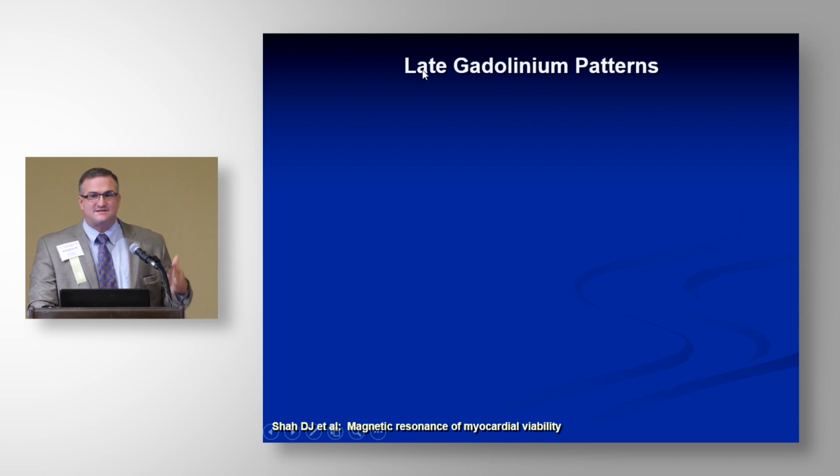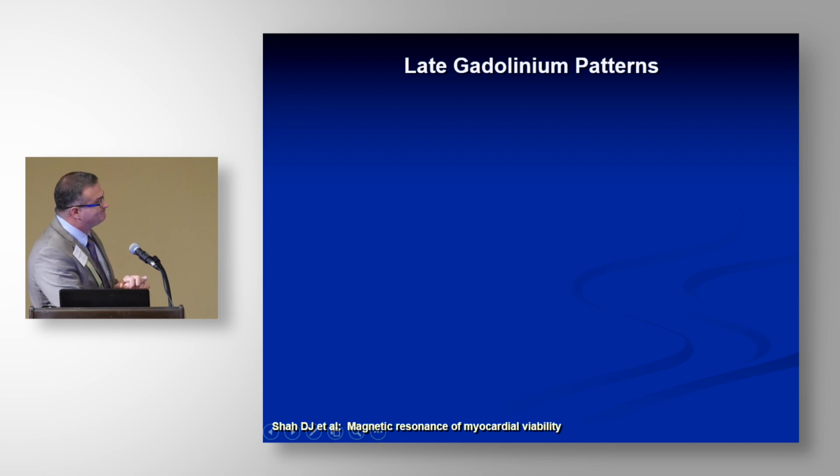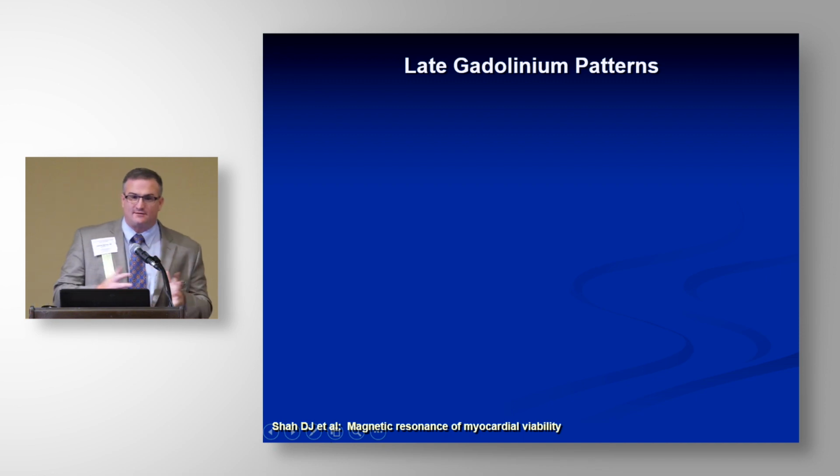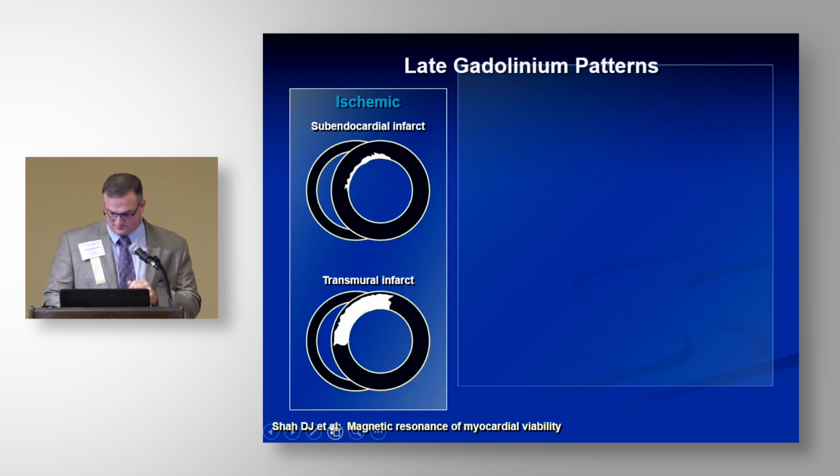So the presence of late gadolinium is not enough. It's not dichotomous. It helps you. The pattern of late gadolinium enhancement is critical. And there's a slide coming that will help illustrate that. I hope any moment. There we go.